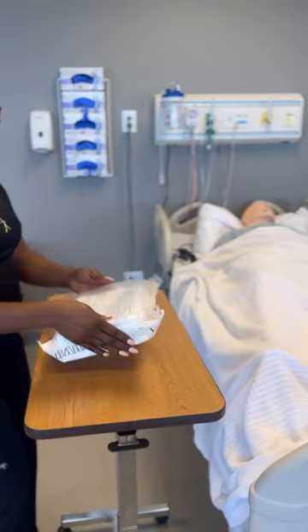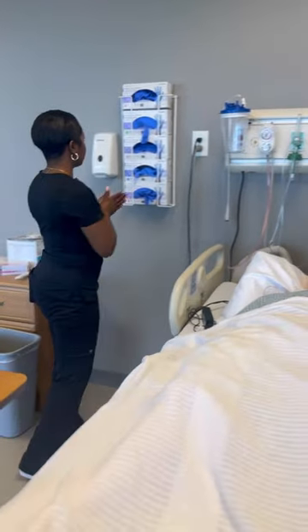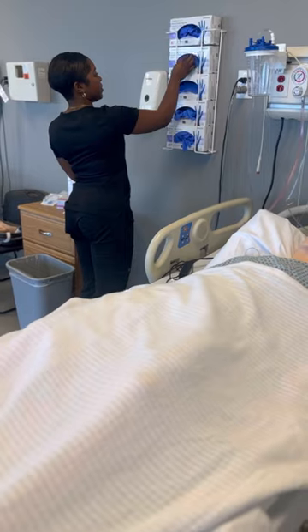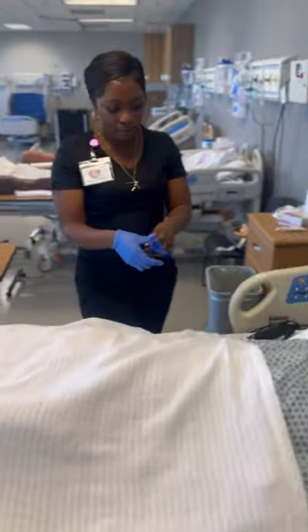Urinary, or Foley catheterization, is a tube that's placed through the urethra into the bladder in order to remove urine. Catheters should only be used when necessary to improve patient outcomes and their well-being. The main reason that the patient would have to use a urinary catheter is for urinary retention.